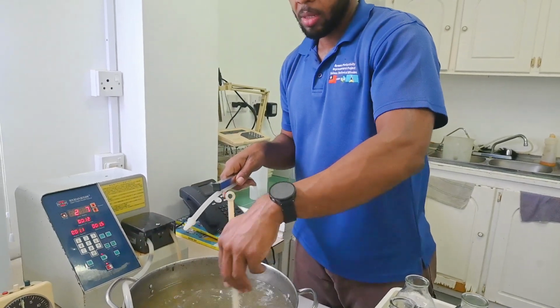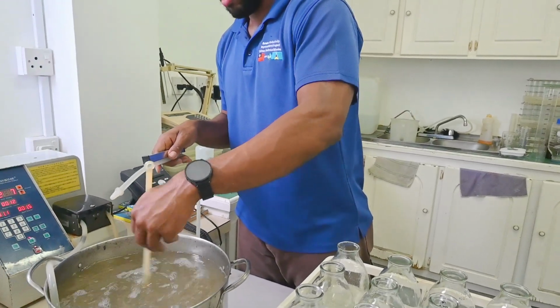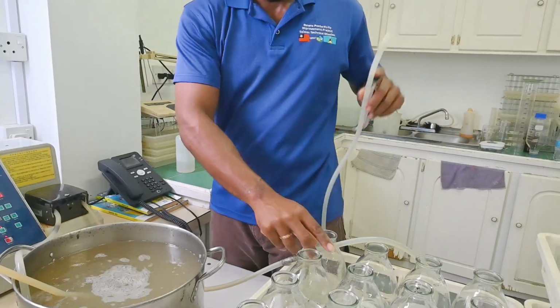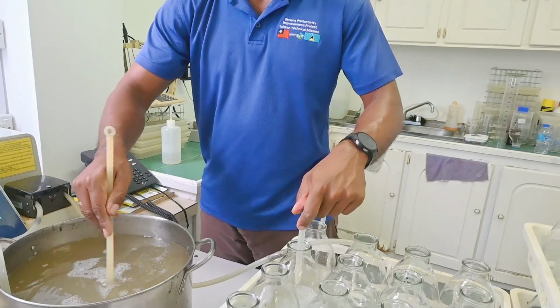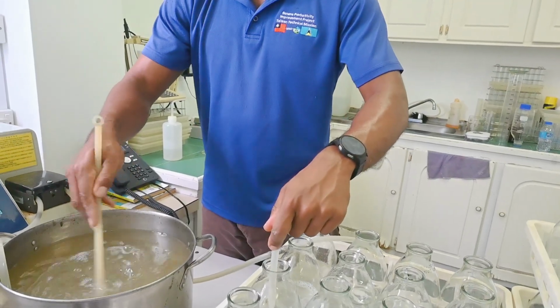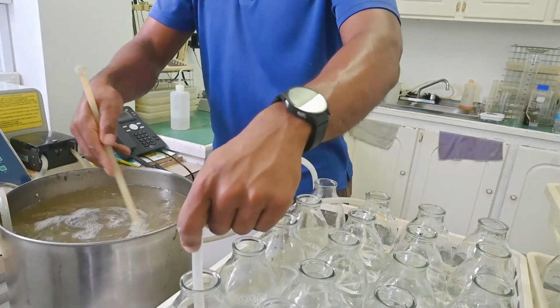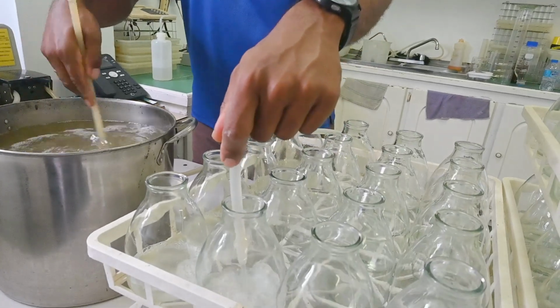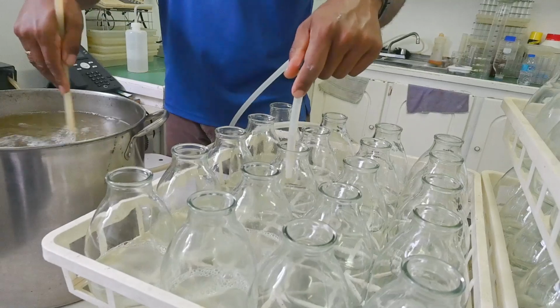Now we're going to dispense the same amount into all of these bottles. Starts and stops automatically based on the time you set it. Just always have to keep stirring to ensure that the amount of agar is uniform.